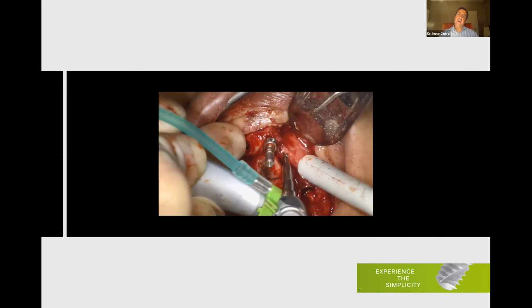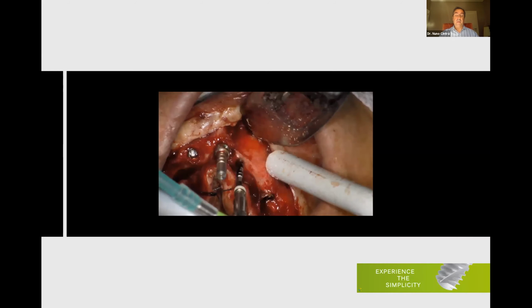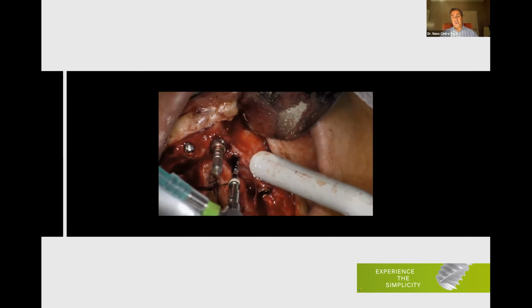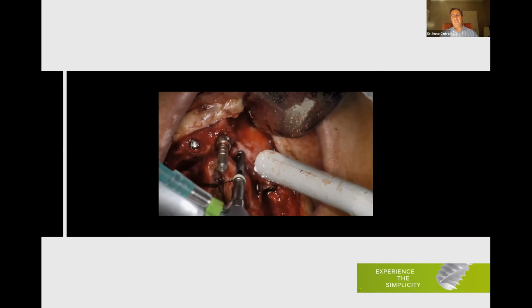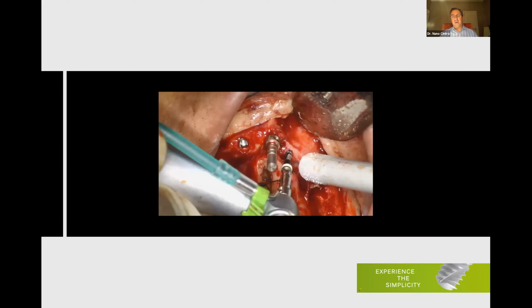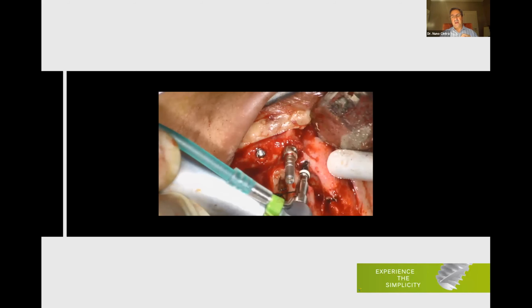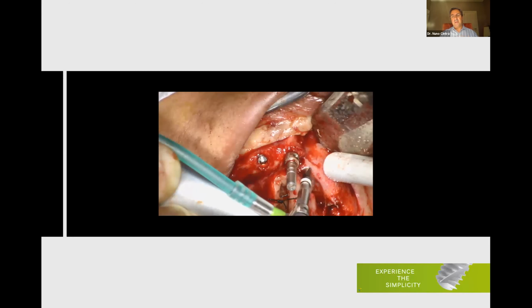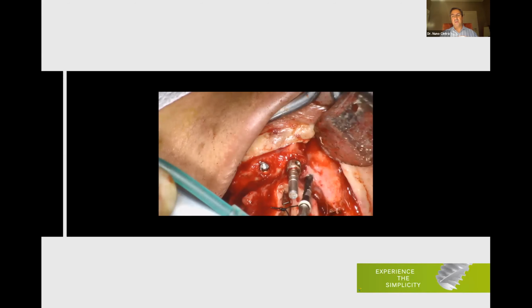I like this implant very much because apart from being coated with calcium phosphate, due to the shape and anatomy of the implant, it allows some bone expansion. It works as an osteotome. So even on a very thin crest like this one, as you can see, this is a 2mm drill. We have what? We have 1mm left. The 3.5 implant will expand the bone. It will expand the bony walls.